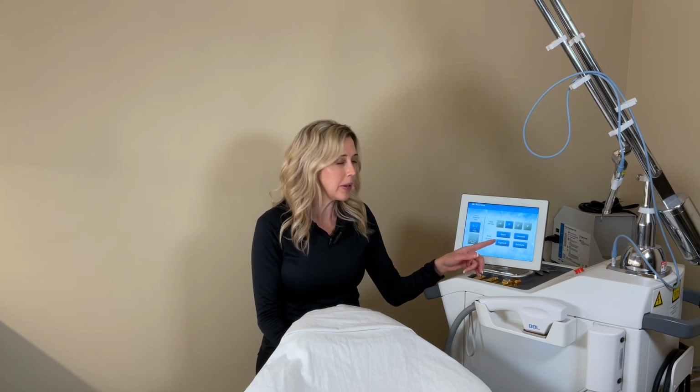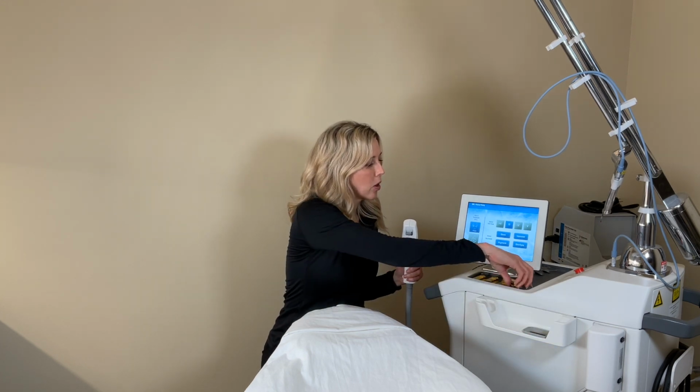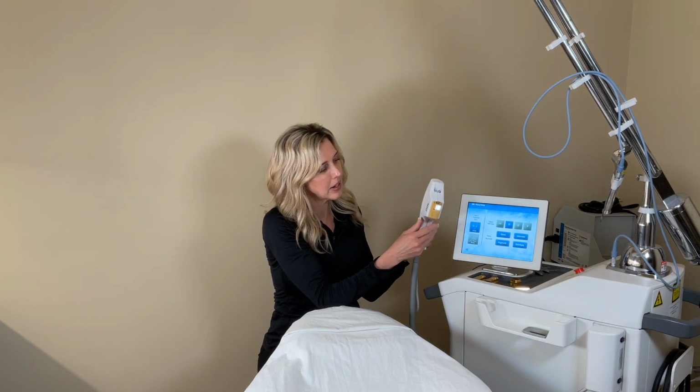Then there is the pigment pass. So for browns, that would be the next pass. For the browns, we are using a smaller spot size like this. I'm going to go over the entire face. If this is the first time I'm doing it to someone, I'm going to go over everything, because there's a lot more brown under the surface of the skin than we can typically see.